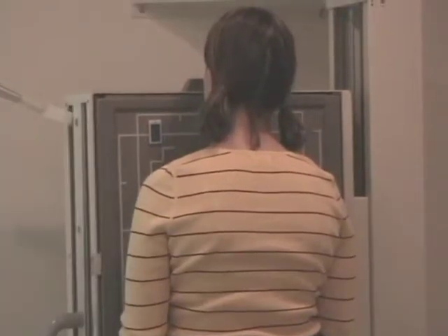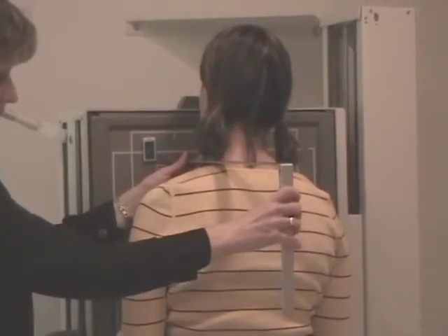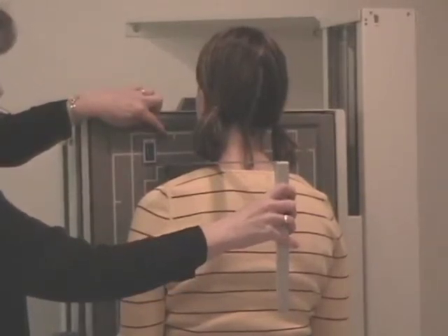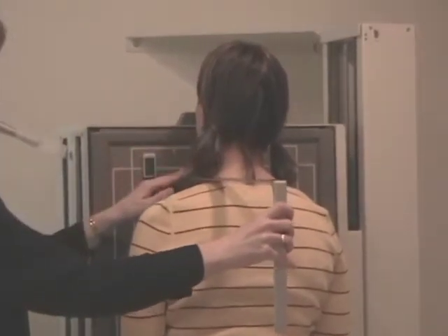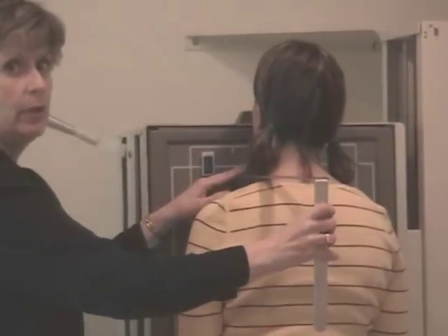And when you're first starting to position, using calipers like this and looking at the film's edge being 2 inches above is a very good trick to use. I want to make sure there's film clearance above the apices of the lungs, or I will clip pertinent anatomy. So I like the film height placement.